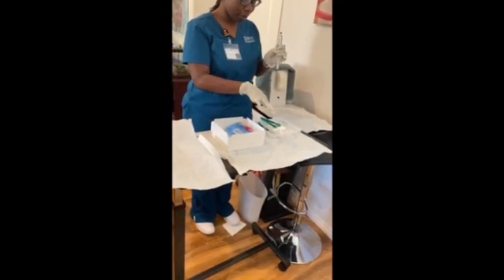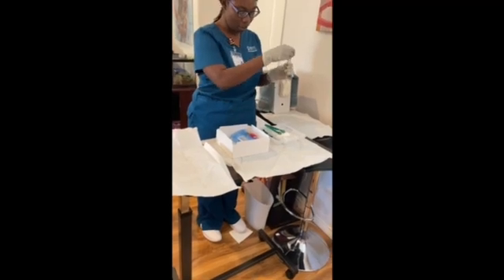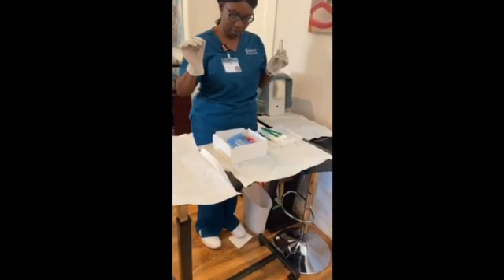During this time, if I were going to do a urine specimen, I will open the specimen container.